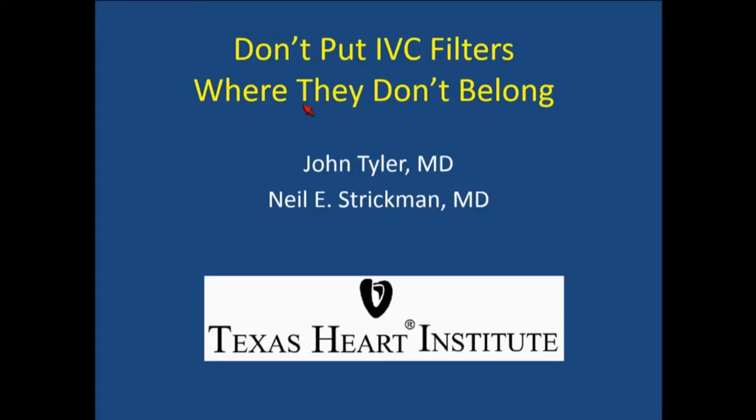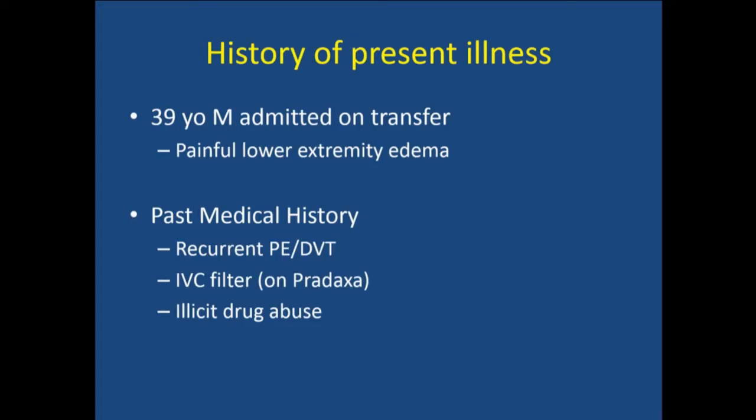We'll discuss a difficult IVC filter case today. I have no disclosures. The patient is a 39-year-old male admitted on transfer from an outside hospital for painful lower extremity edema, left greater than right. His past medical history is significant for recurrent pulmonary emboli and deep venous thrombi. He had an IVC filter placed at an outside hospital about 6 months prior to this presentation, is prescribed Pradaxa right now, and has an ongoing habit of illicit drug abuse.